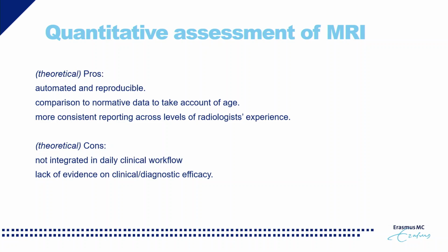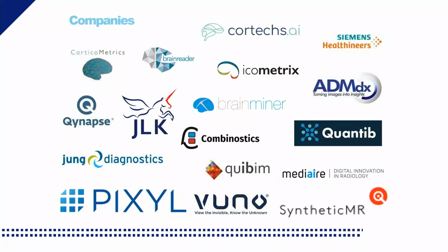But cons could be that it's not integrated yet in the daily clinical workflow, so it might take extra time, and there might be a lack of evidence on clinical and diagnostic efficacy. So we're going to look into that. About software not being available, there are currently a lot of companies, and here you see a wide selection of them, that have such software available on the market.